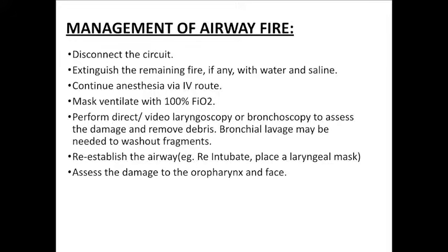First thing, disconnect the circuit, extinguish the fire with water and saline, continue IV anesthetic agent, mask ventilate the patient with 100% oxygen, perform direct laryngoscopy or bronchoscopy to assess the damage and remove debris. Bronchial lavage also can be done, and re-establish and assess oropharynx and face.